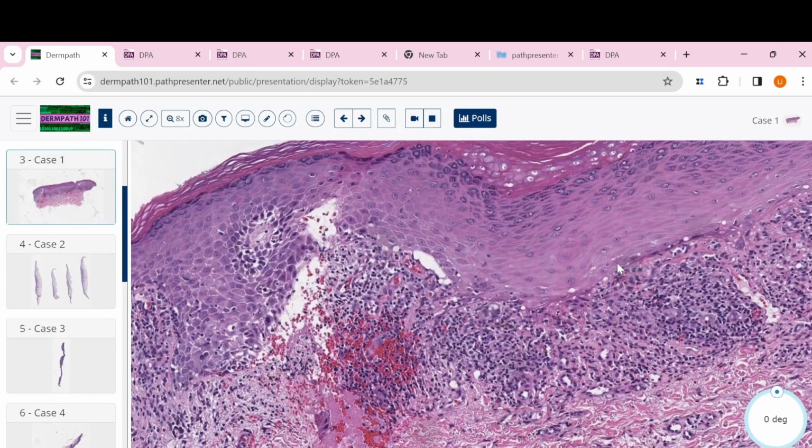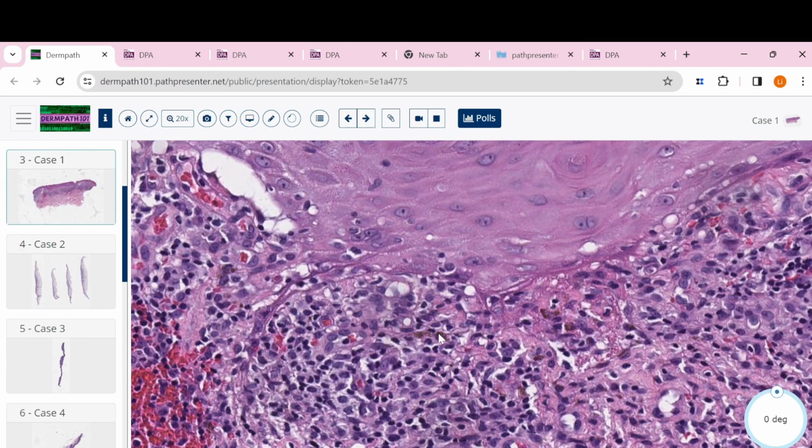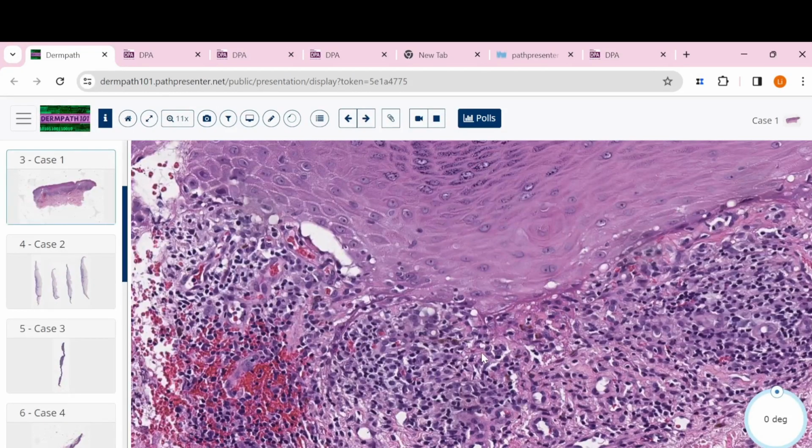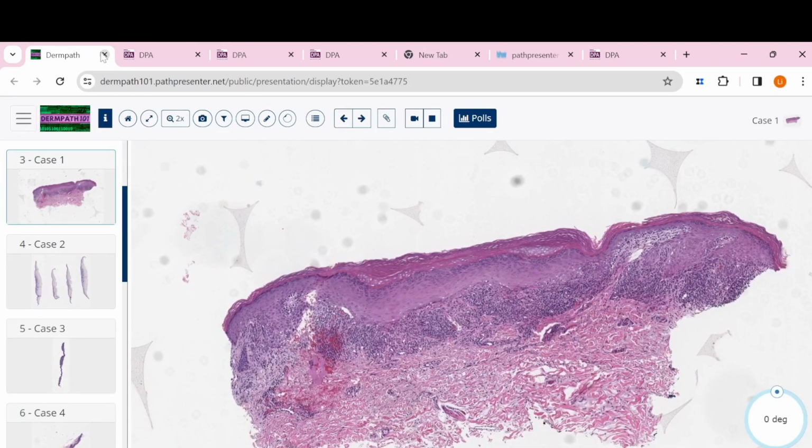Usually our melanin just stays in this basal cell layer. So if the lymphocytes attack this DEJ, this melanin pigment will drop out. That means this pigment will go to the dermis, something like this. Because the lymphocytes attack the melanocytes, maybe the keratinocytes, the pigment will just go down. So this is another case of lichen planus.